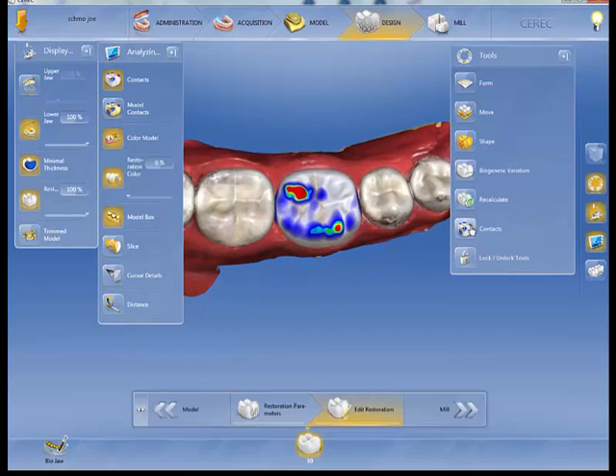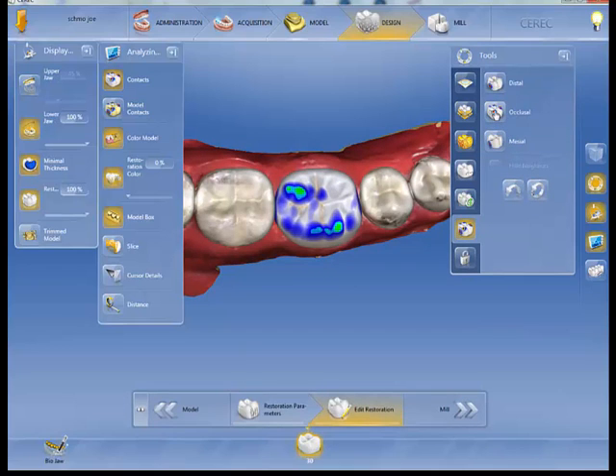But if I'm happier with the position of this tooth, I could go to Contacts, hit the occlusal contacts, and have it grind it down for me.